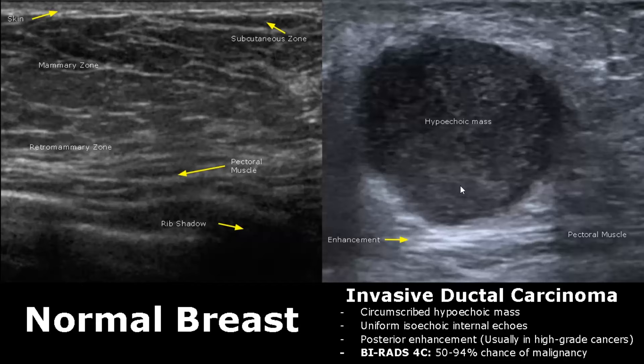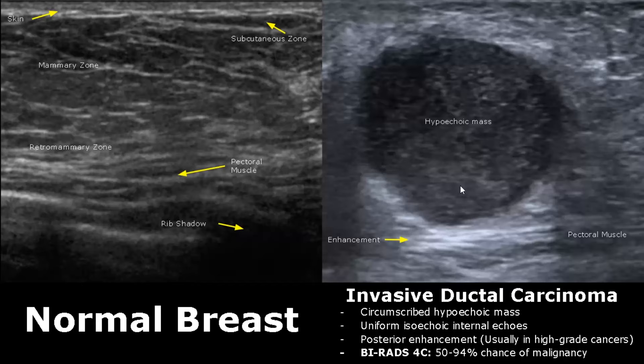Here we have another image of invasive ductal carcinoma showing a circumscribed hypoechoic mass with uniform internal echoes. It also has posterior enhancement suggesting a high-grade cancer. This illustrates that invasive ductal carcinoma has many appearances, and ultimately it is confirmed with biopsy.